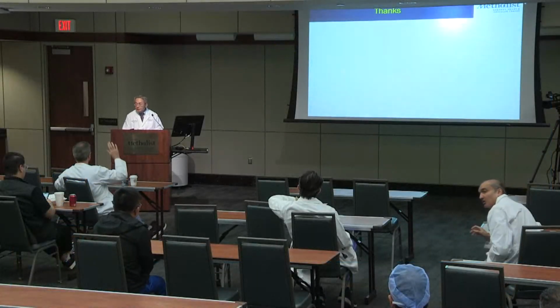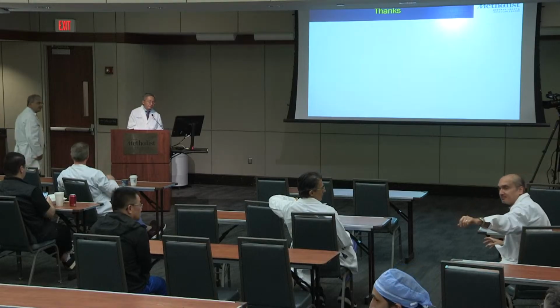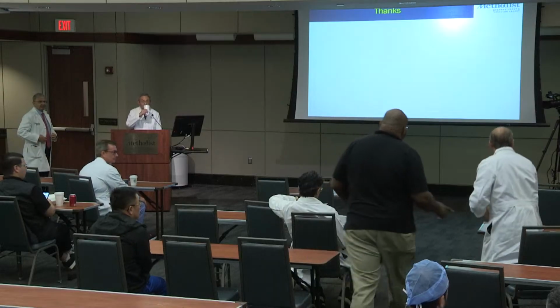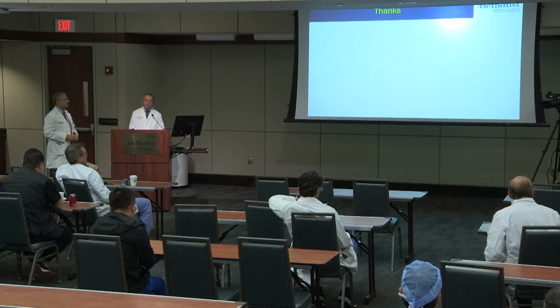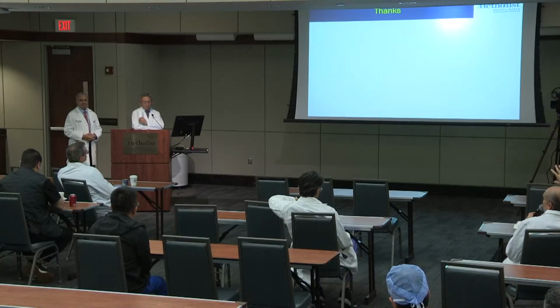Any question? Yes, Steve. All right. Well, first off, Bill and Sumin, thank you very much. This is really outstanding, and it really kind of highlights the value of multimodality imaging.